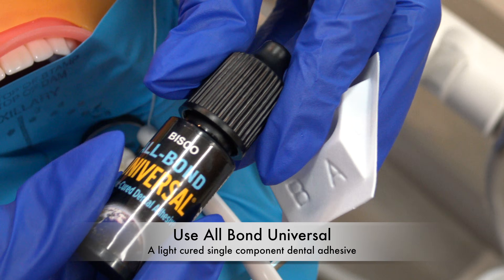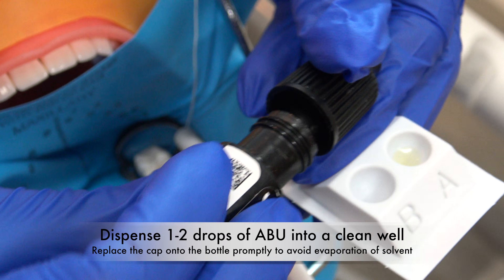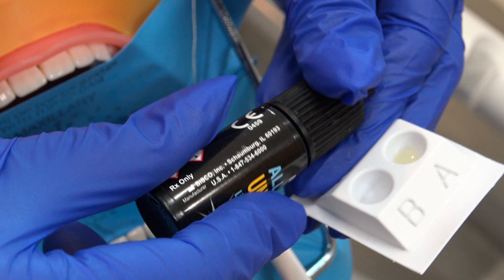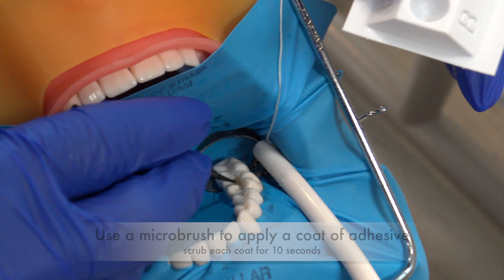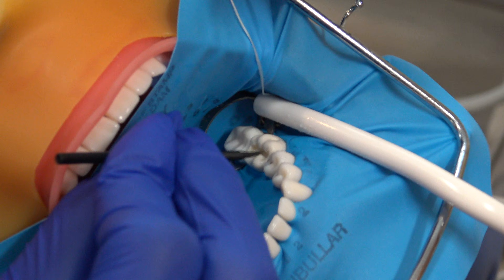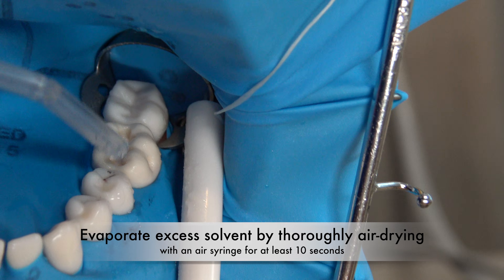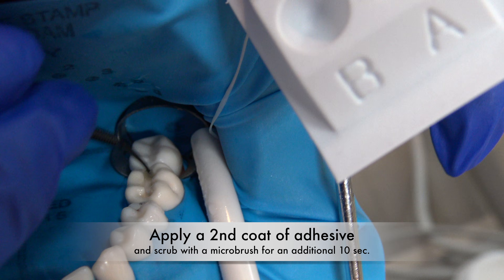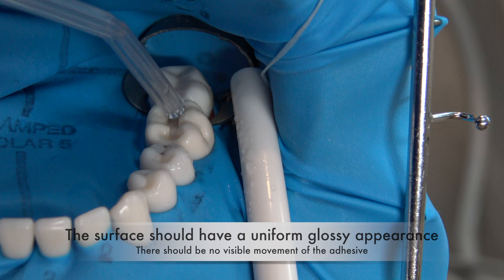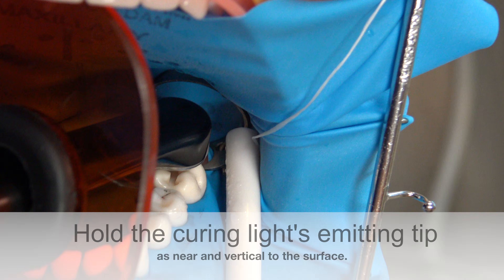Use All Bond Universal. Place one drop into the well. Then use a micro brush. Apply the adhesive to the cavosurface margin — 10-second scrub. Air dry. Apply a second layer generously, and cure.